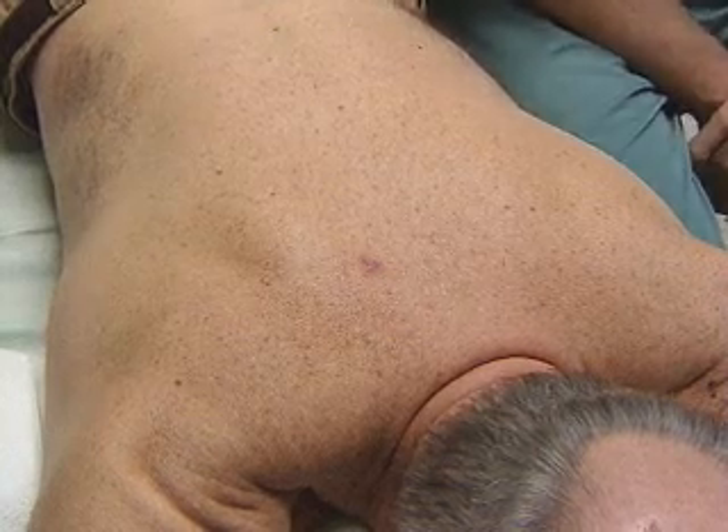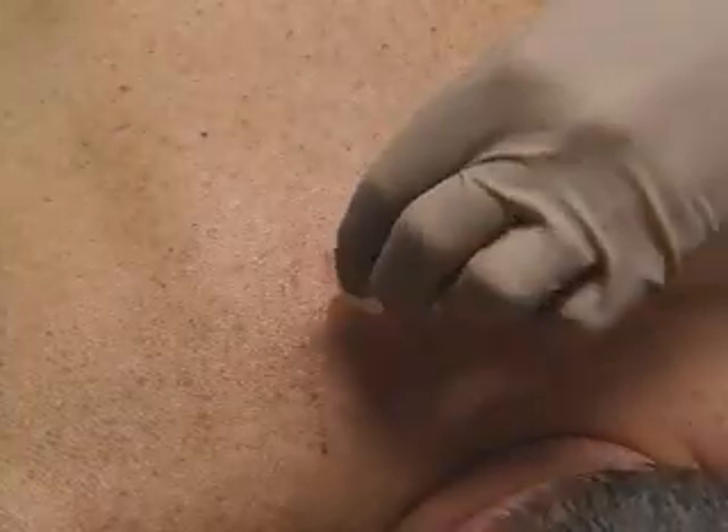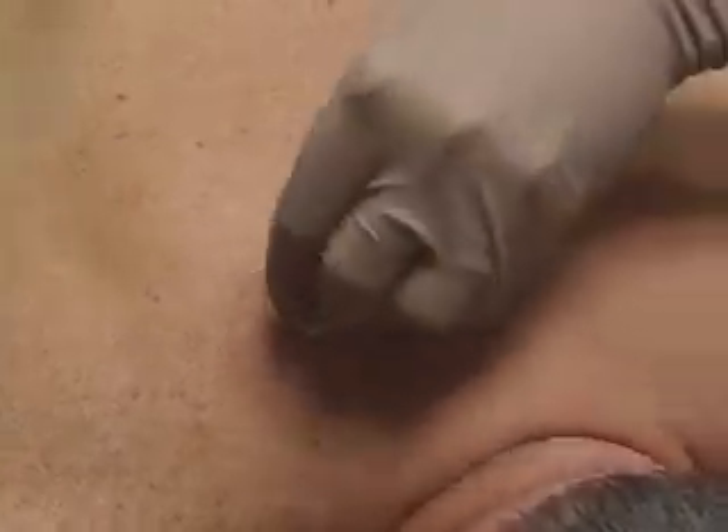We're preparing this patient for removal of a sebaceous cyst. Sterilize the area with chlorhexidine, swabbing in an outward spiral.